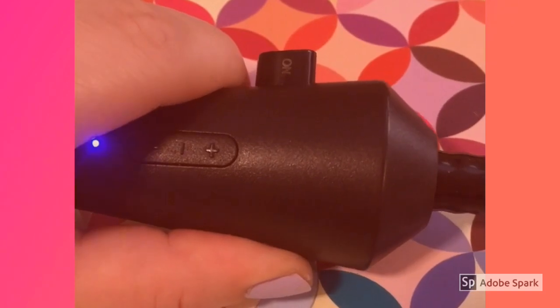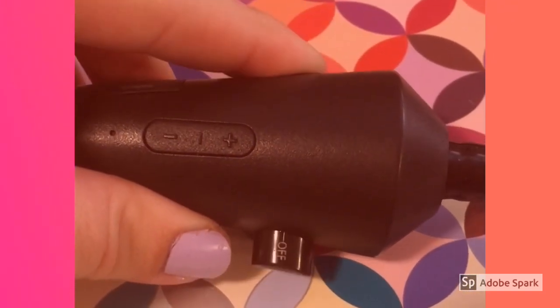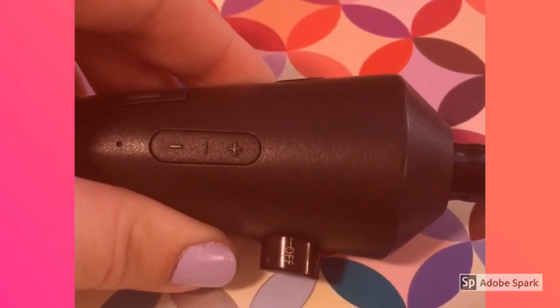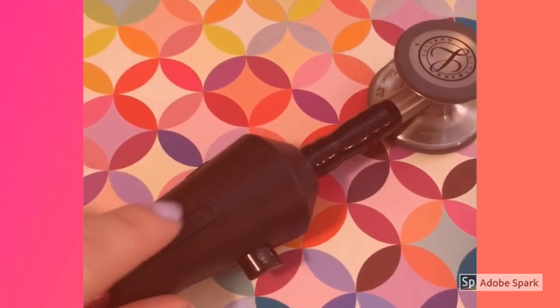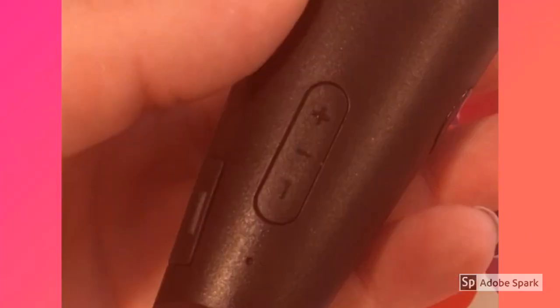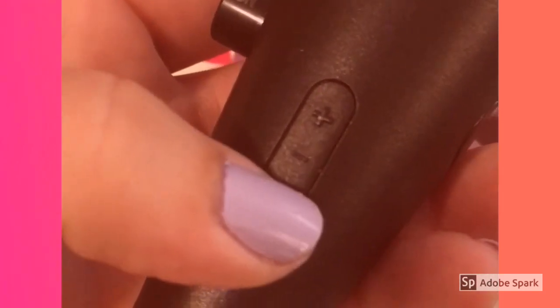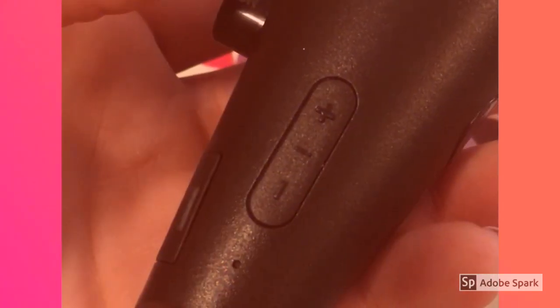It's easy to click on and off, but it's not so easy that you're gonna accidentally turn it on when you don't mean to. I also like that when the diaphragm is flat, the volume controls are then on the top for easy access. The blinking light changes from blue to green when you're adjusting the volume, and you can feel the click as well.